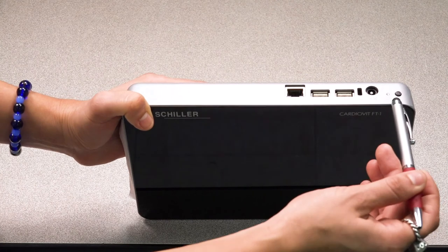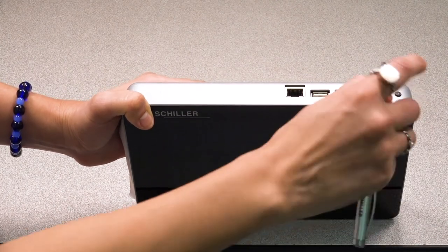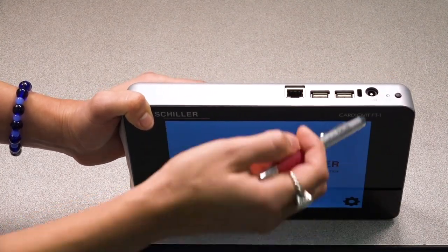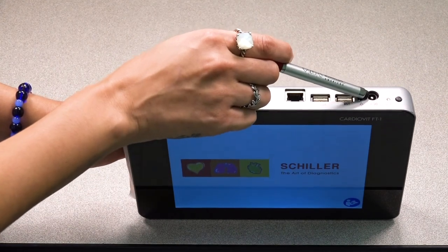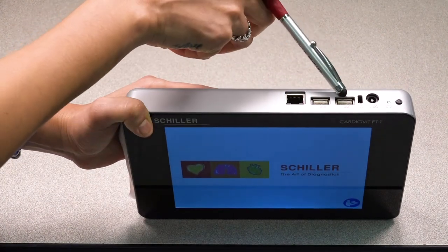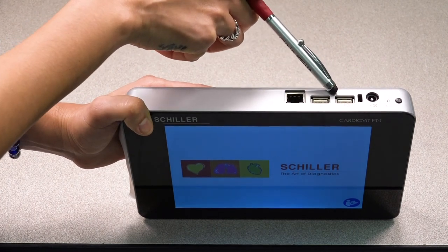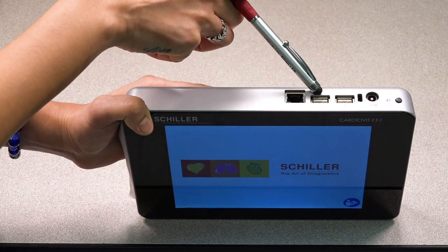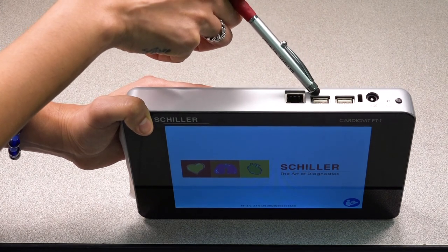You'll find the power button at the top right corner, followed by the charging port for the charger. You'll also find two USB ports used to update the unit's software or to export the ECG reports into PDF format.